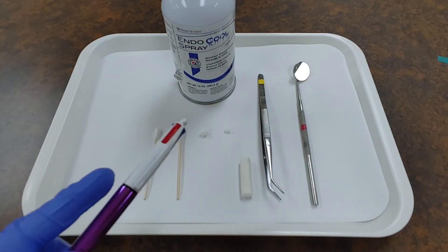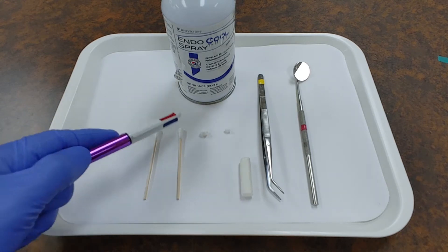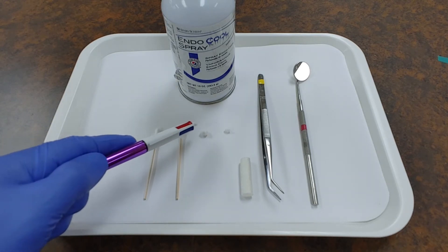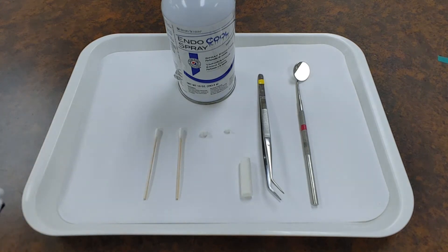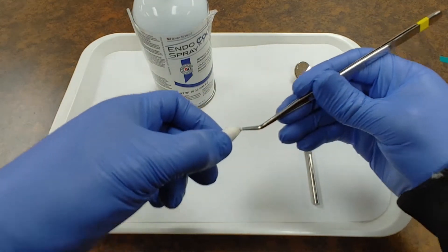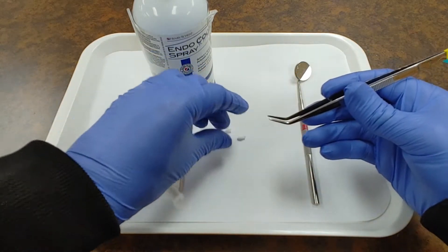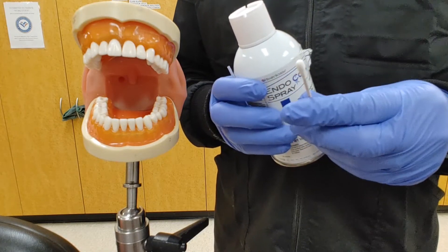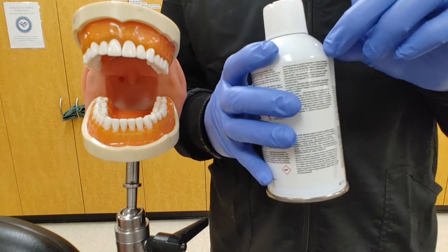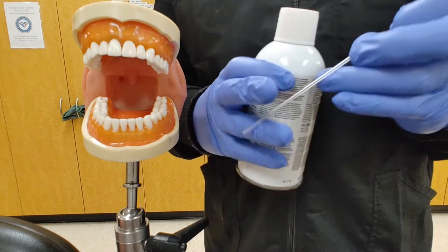First we're going to begin with our cold test using some type of spray or ice. We're going to be applying this to our cotton tip applicator or a cotton ball made from a cotton roll. A quick method to make a cotton pellet on the fly is just grab a cotton roll and your cotton pliers and pull at the ends until you have an appropriate size. We'll start with our cold spray and a cotton tip applicator. Usually you can find a straw on the side of the can but that tends to get lost.